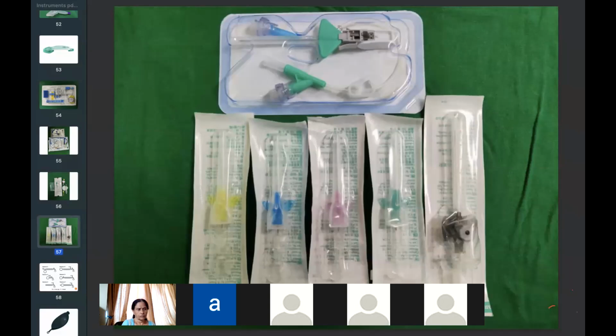And when you are putting it in, how will you look after this basic IV cannula, and what are the complications that you can face? Ma'am, the complications can be pain, ecchymosis, double punctures, and tissued cannulas. There are some less common complications like nerve damage, arterial puncture, thrombophlebitis, and tissue necrosis. As a guide, the cannula should be changed every 24 hours. Sorry, every 72 hours, I'm sorry.